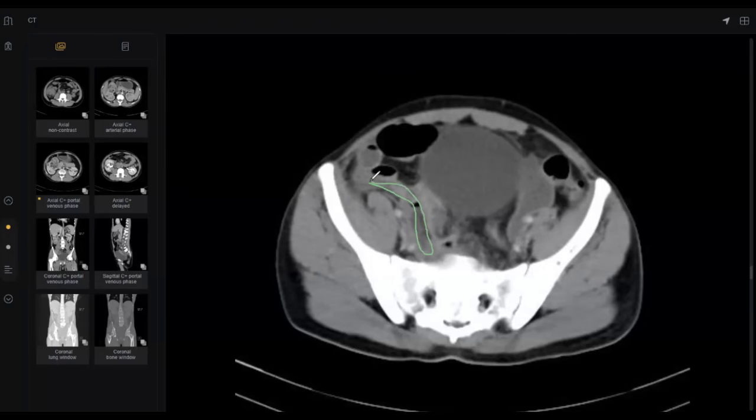Behind the ileocecal junction. Okay. So don't ask too much in MR. In MR examination, you have the right to ask for post contrast, for FLAIR, for diffusion, because it is a must. But in CT, they like too much to work on axial because axial is the origin of CT.